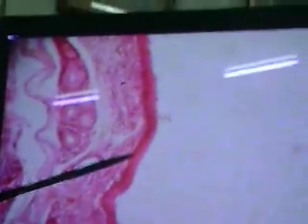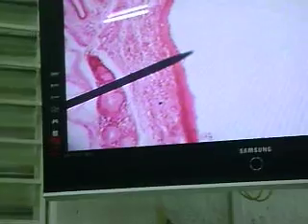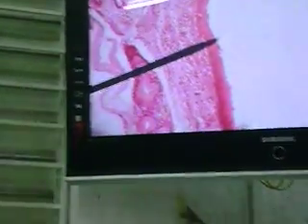Lymphatics. Alright? If they're setting you a slide in the exam for the posterior third of the tongue, it must show lymphoid tissue. And those are the lingual tonsils. Okay? So we need to define between all of these things. So as I said, there is the overlying epithelium. I would think that 99% of the slides that we have of the pharynx are taken either from the oropharynx or the laryngopharynx.